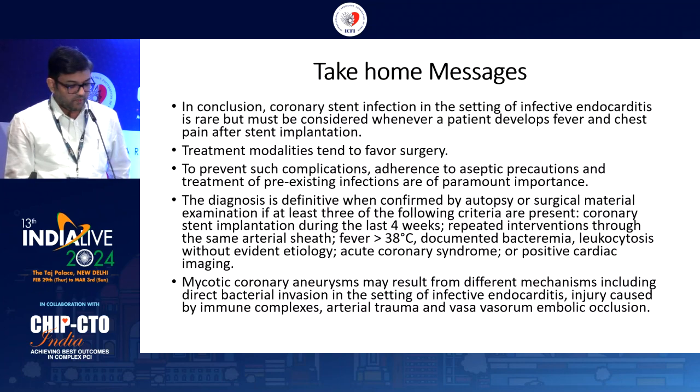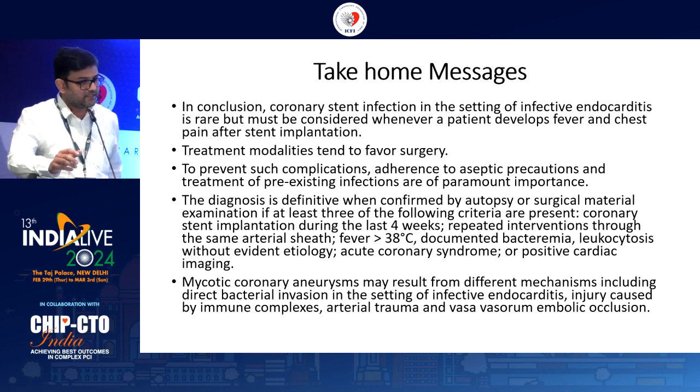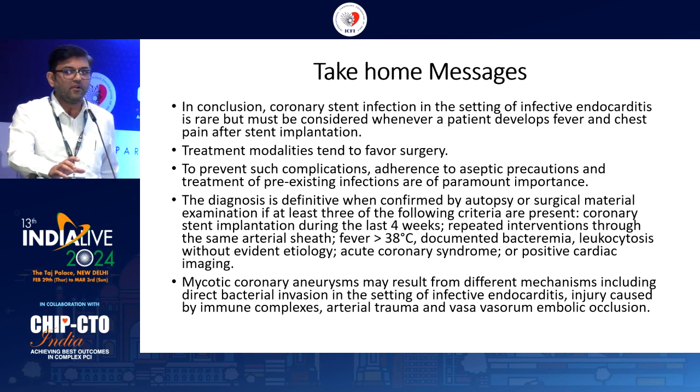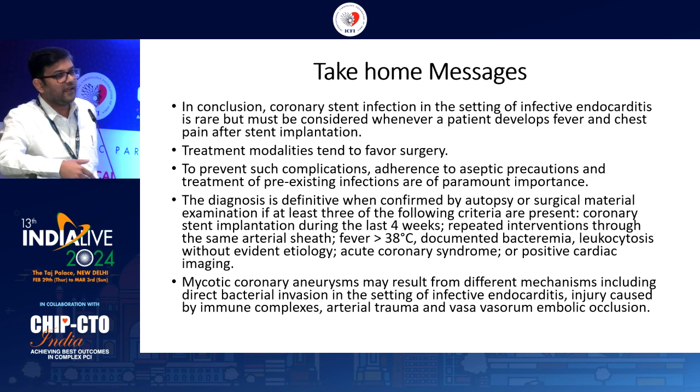So this is one complication. I think what happened here is that the stentitis happened all because of the aggressive pre-dilatation and post-dilatation. We created an extensive dissection in that area, and that is the reason why the stentitis happened to this patient.